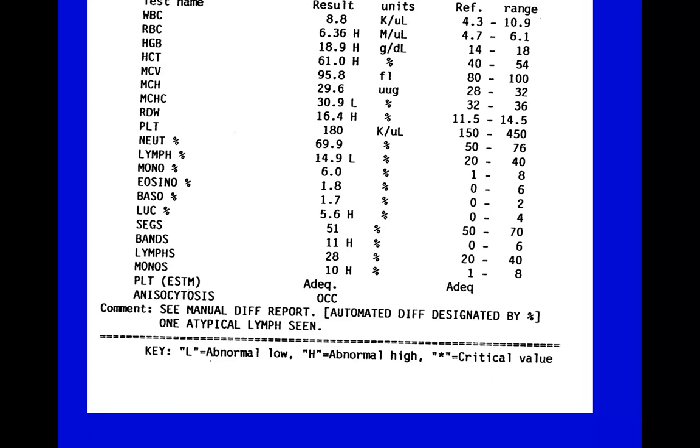If there's inflammation or infection, it will typically cause the white blood cell count to elevate outside its normal range. Or if the infection or inflammation is starting to overwhelm the body, we would see that decrease. So based on the white blood cell count alone, I don't see evidence of inflammation or infection. But when I come down to the differential, which is reported as percentages, here's my neutrophils, here's my bands, here's my segs. Up here they put them all together, and then they split them into the mature ones and the immature ones. I don't have any of those promyelocytes or metamyelocytes.